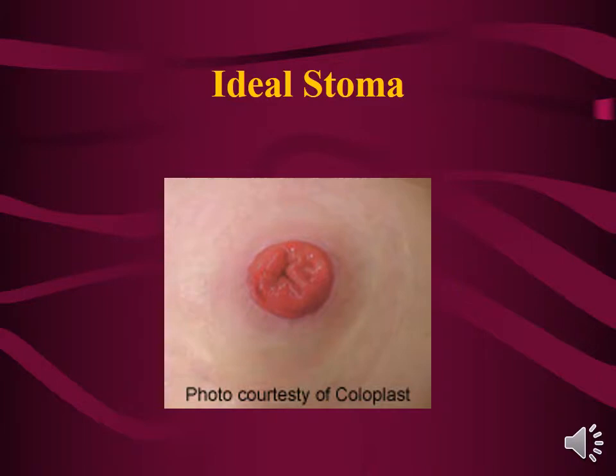First, this is an ideal stoma. You won't see this very often. It's beautiful. It looks like the inside of the mouth. If you were to clean this with normal saline and a gauze, you might get a little blood on the gauze and the patient would be concerned, but that would be okay because it should have lots of blood flow, and it cuts very easily, just like the inside of your mouth would.